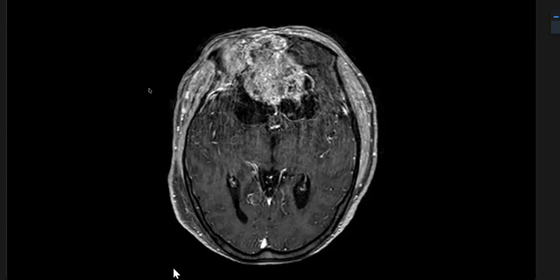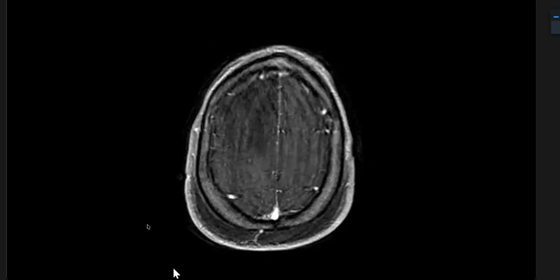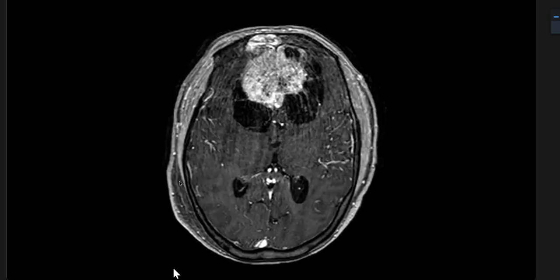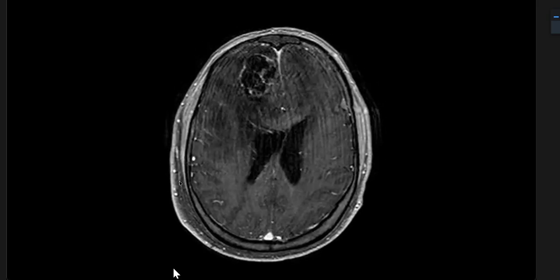Don't have a scattergun approach. The lymphoma, GBM, then you say something else as well. Destructive region here, there. Then you jumped onto the extradural, sorry, scalp hematoma, subgaleal hematoma. Why? Okay, so just be focused. Try to be short and sweet. You're taking too much time in this, and you're wasting time in the exam.